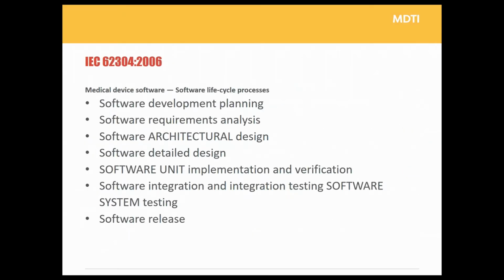So today what I want to do is concentrate on looking at IEC 62304 as a template of a standard for the development of software for inclusion in medical devices. Broadly accepted as, you know, it's about software lifecycle processes. It's not the be-all and end-all, but it's an awfully good starting point. And it aligns very closely with the FDA requirements that I mentioned previously. So basically, if you hit the requirements and create the documentation that you've got here on this slide, you're going to be pretty good for your regulatory submissions coming forward.